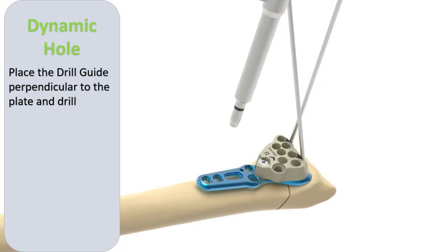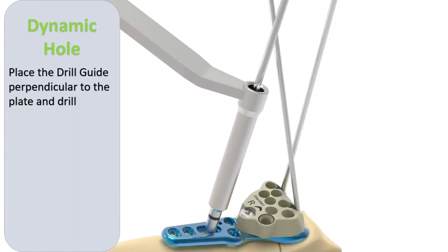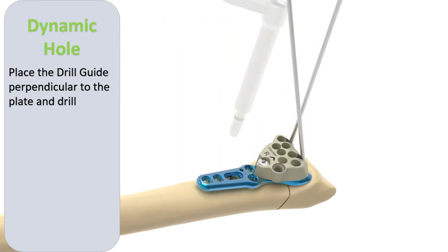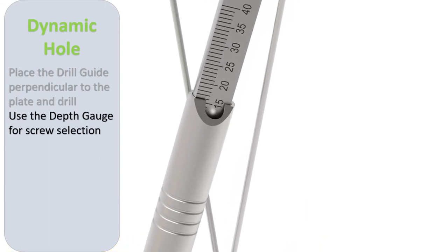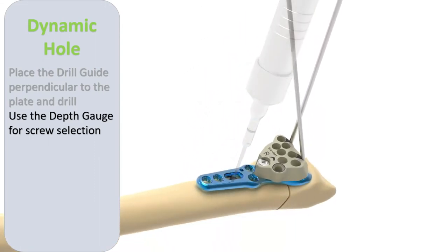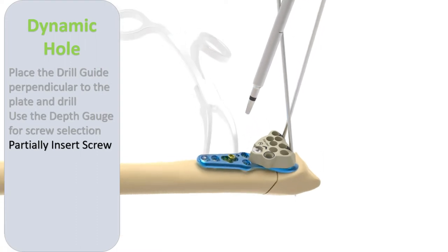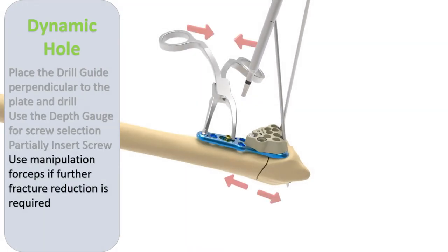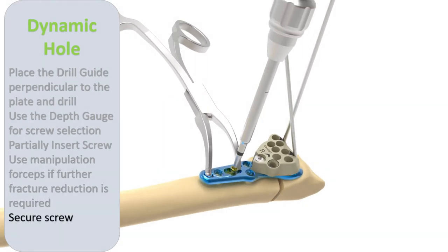The non-locking screw is then inserted in the central portion of the gliding hole by lining the drill guide perpendicular to the plate. Partial screw insertion allows the manipulation forceps to be used for achieving either compression or distraction at the fracture site, allowing for correction of radial shift. Once this manoeuvre is complete, the screw is seated home.